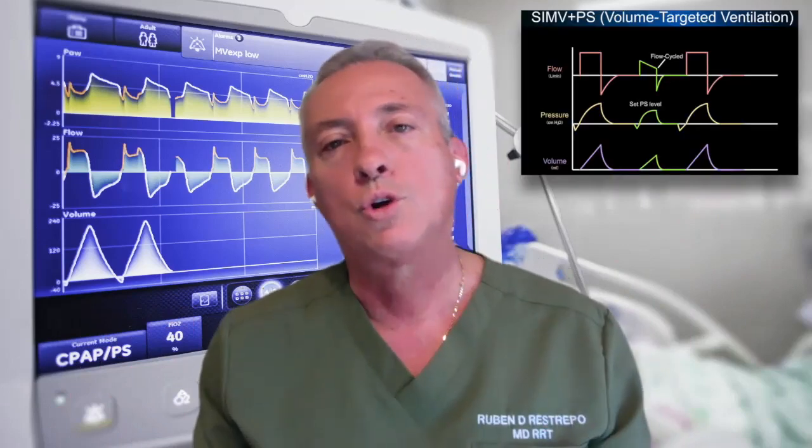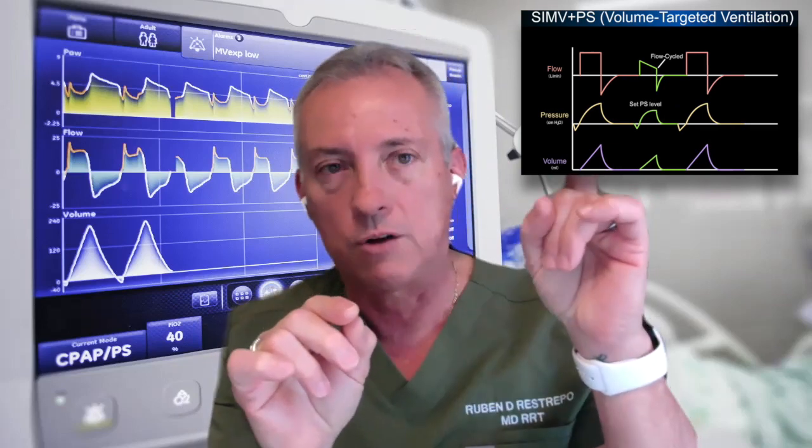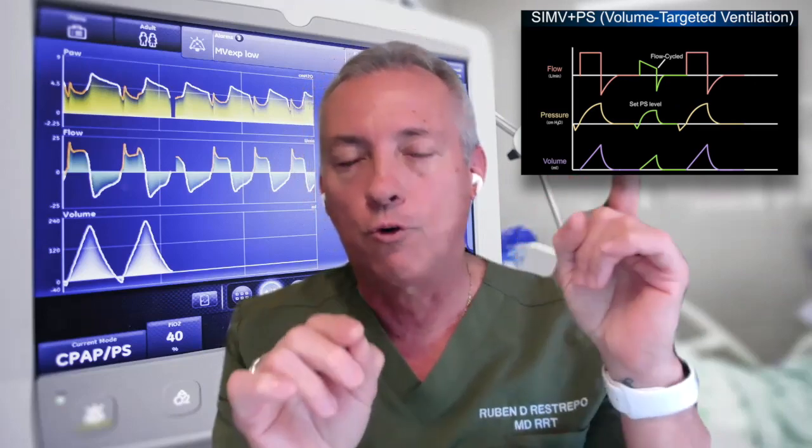So I think it's very clear that when you have less than 4 mLs of exhaled tidal volume on those spontaneous breaths, remember, you see this tiny breath, just look at the tidal volume exhaled. If that is less than 4 mLs per kilogram, you need to up that. While there may be different opinions, let's say my target is about 5, no more than 6 mLs per kilogram, because I don't really want to match what they're getting mandatory. Might as well just put them on assist control. So if the target is about 5 mLs per kilogram, I would be happy because that's the way I'm helping the patient to boost their spontaneous breaths to get at least 5 mLs per kilogram.